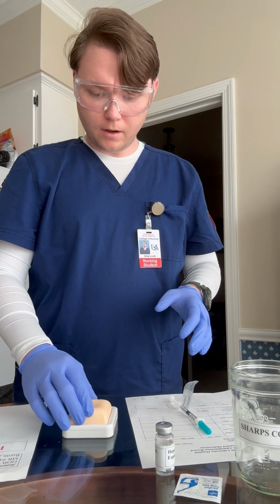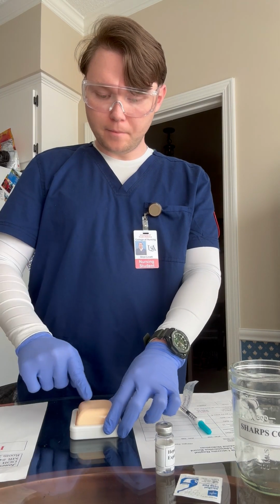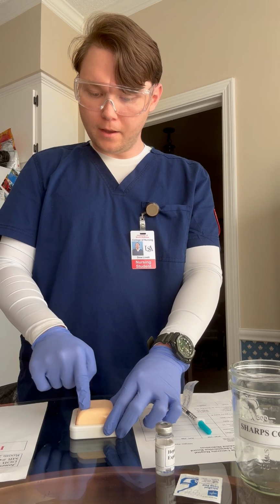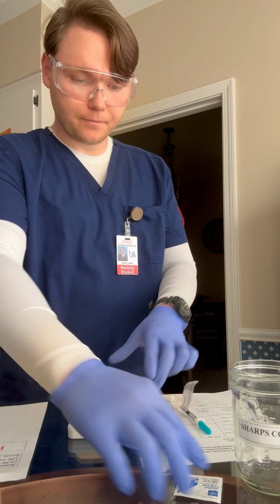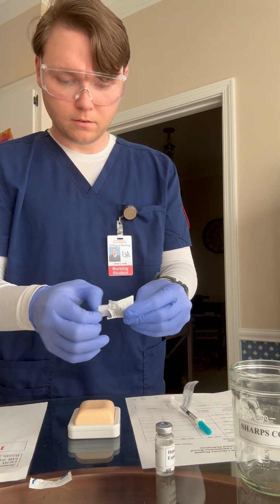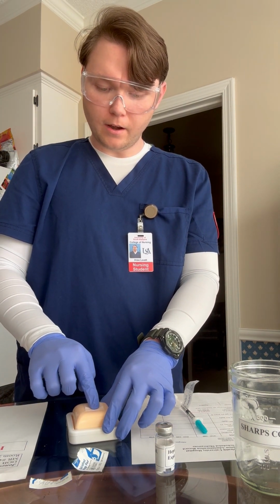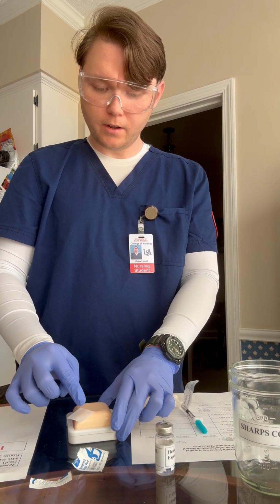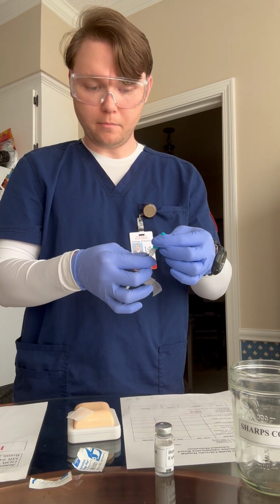Okay, and all right, I'm going to pull back his gown. All right, and this is his abdomen, his lower abdomen. So I don't notice any bruising or discoloration. All right, palpating, do you feel any pain or tenderness? All right, good. Just going to clean this area. Let's see, squish it. All right. So I'm going to clean in an outer circular motion, being careful not to go over any area that I've cleaned already. I'm going to leave that there to mark where I have cleaned and where I'm going to be injecting.